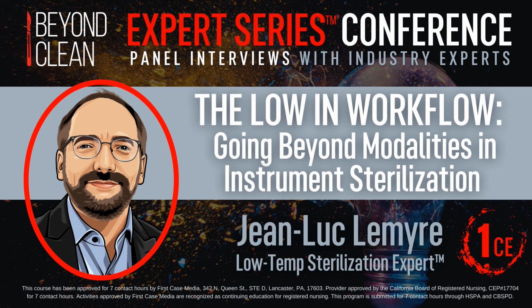Then there is typically a sharp increase in pressure, a pressure push, either by injecting air or a different gas that will further drive the peroxide into the lumens mostly, but other hard to access areas. And the peroxide there can react with the microorganisms that are hidden in your lumens, on the surfaces and cracks. And as I mentioned, it's a very reactive molecule. So when you've got enough peroxide on a microorganism, it will chemically destroy it, basically.